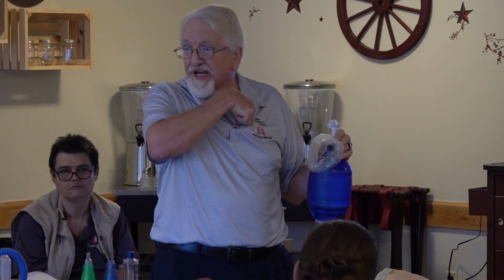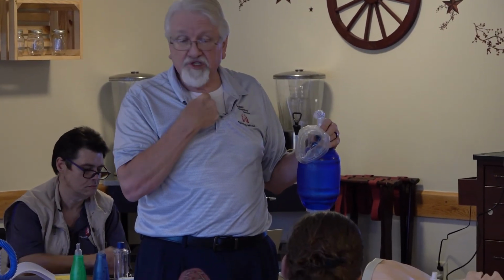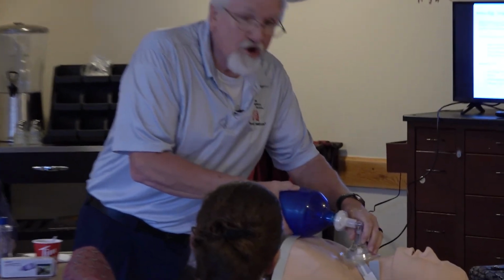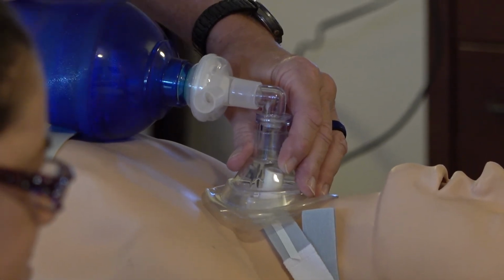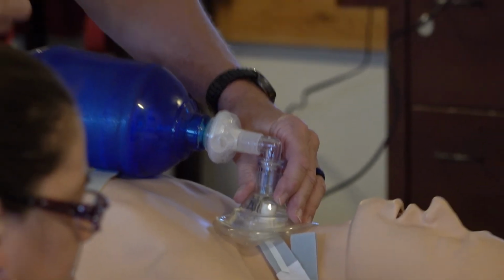So if I have a laryngectomy patient, remember, if I go like that, he can't breathe. None of this up here matters anymore. I'm concerned with that right there. I'm going to use the mask, make the seal over the stoma, and give him his breath. Okay?